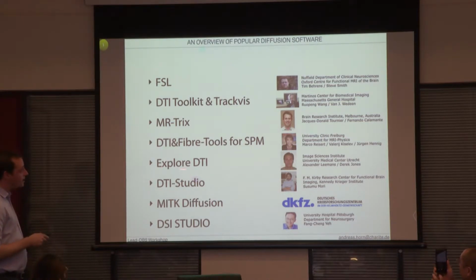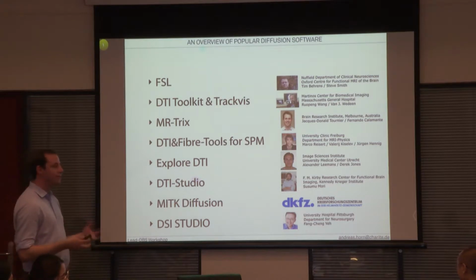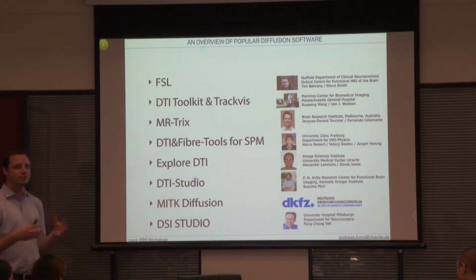Then for people that like MATLAB, ExploreDTI is a really good software. It's developed by Alexander Leemans and Derek Jones, but I think more Alexander Leemans, and he's really a great expert, and he really takes things seriously. So with that toolbox, there's also a lot of quality control options, and you can really explore, as it says, your data.